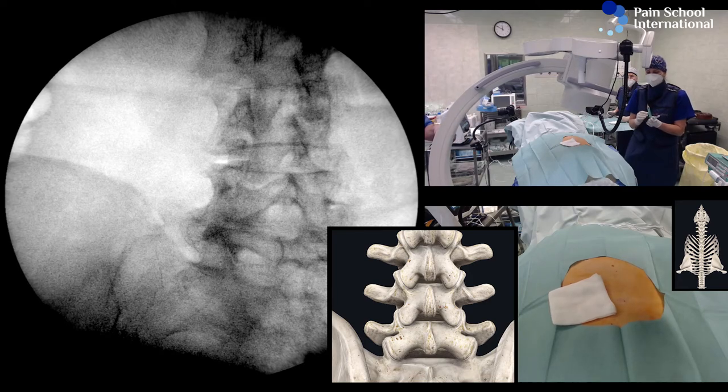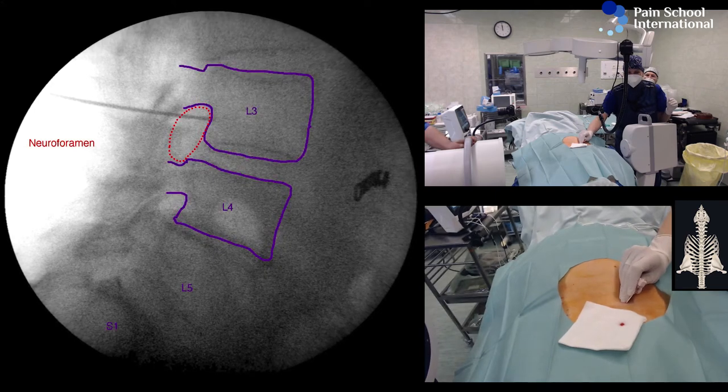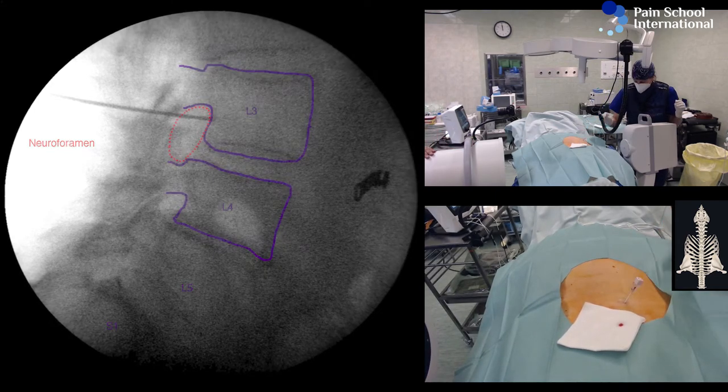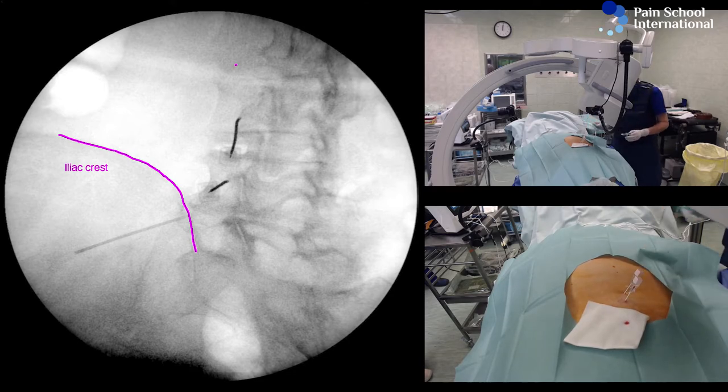Your eyes are on the L3 and L4 disc. That's as good as it can possibly get. If it was really important, we could turn the patient's bed as well.